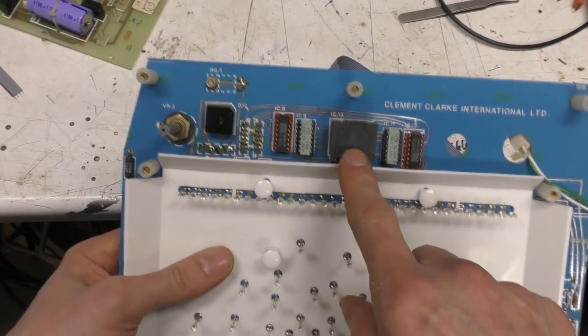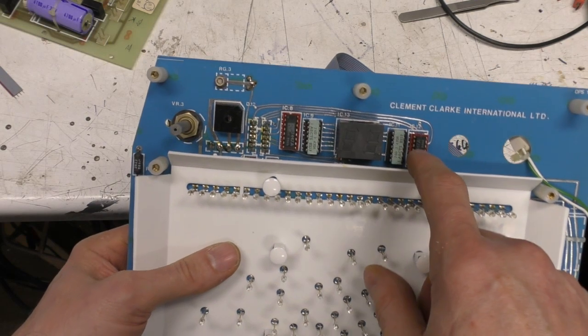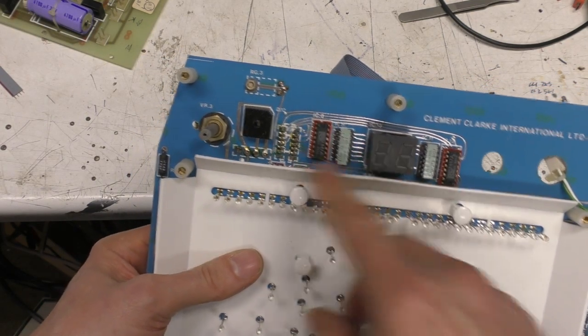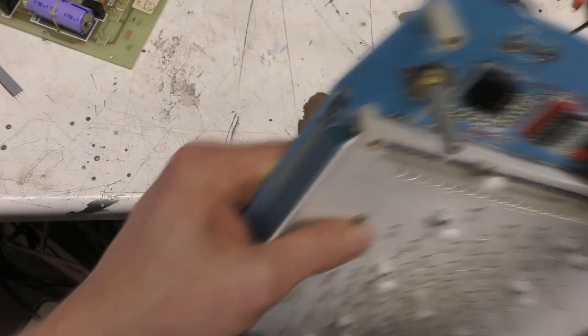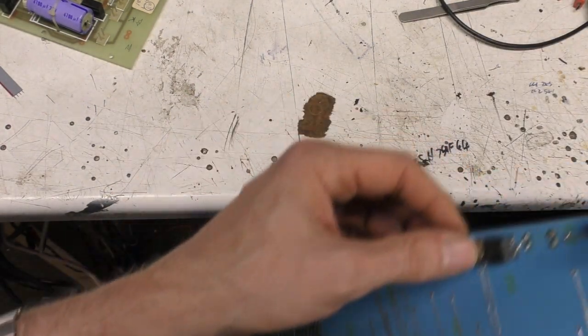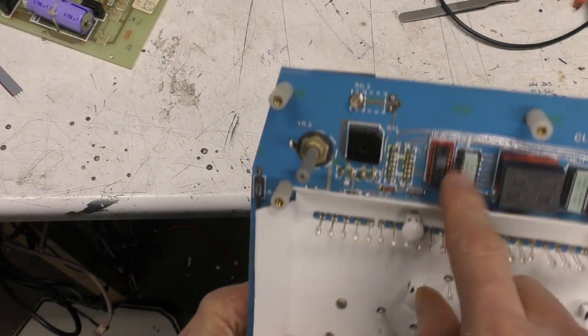Got a 7 segment display for the density adjustment, and a couple of 7447 BCD to 7 segment decoders, so those read switches would have produced a binary pattern that then gets decoded to the numbers displayed on here. There's a rectifier and a cap, so this probably had its own separate AC supply. It's a voltage regulator. You see everything socketed, even these resistor networks.